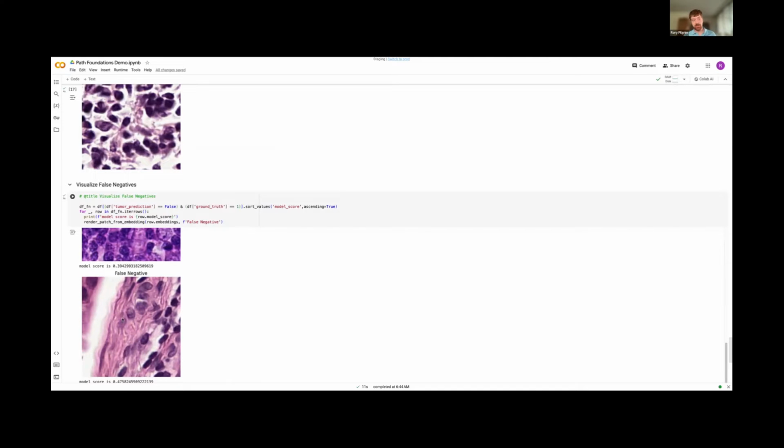So this Colab is actually going to be available for people to run and play around with and just see themselves. This is all on the Chameleon data set, so it's public data. You can test it out and actually train your own model and see what the performance is for you. But more excitingly for us, this is an actual API that's live, so you don't have to use our test set. You can adapt it to fit patches that you have, and we've got lots of code to help you do that. So if you have whole slide images with interesting features and you want to make a prediction that's not tumor versus no tumor, you're more than able to do that with this API, actually run that, train a model, and then see how it works on your data set.